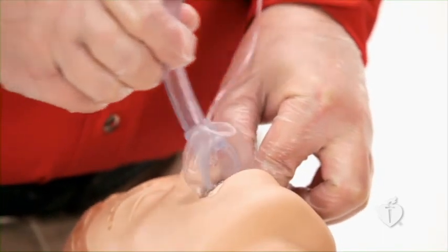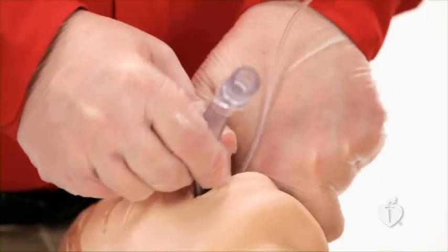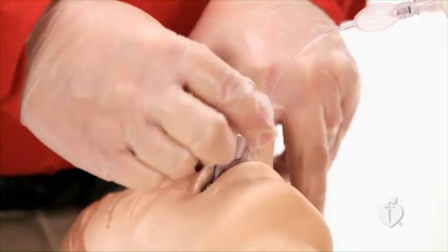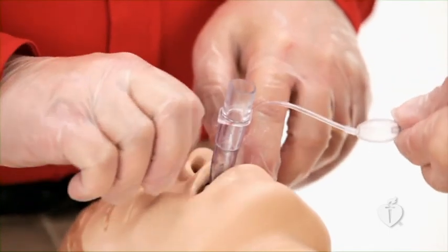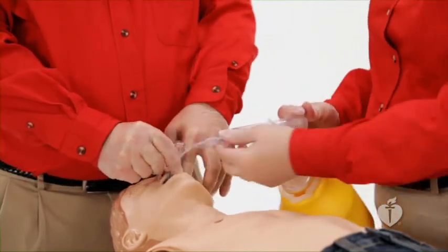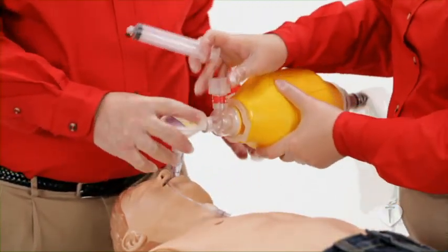Once the device is in the back of the pharynx, use your index finger to press the mask against the roof of the mouth. Continue advancing the device until you feel resistance, indicating that the distal end of the tube has reached the hypopharynx. Withdraw your finger and inflate the mask. Use only the amount of air needed to create a seal, and no more than the volume recommended by the manufacturer. Often, only half the recommended volume is needed. Once inflated, the laryngeal mask airway will center itself in the mouth.